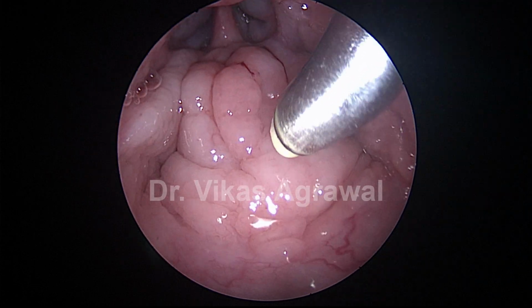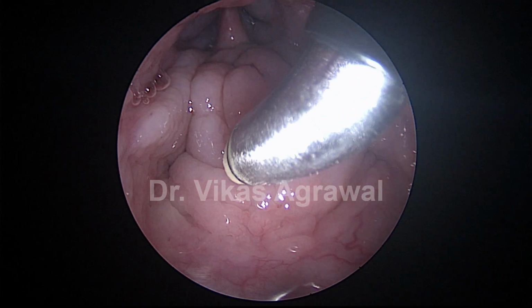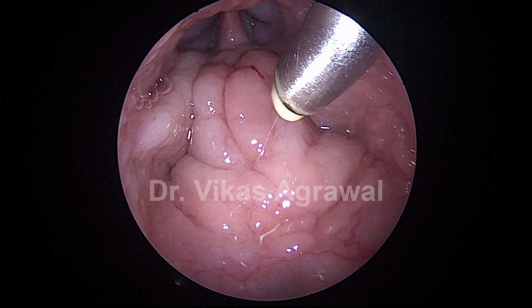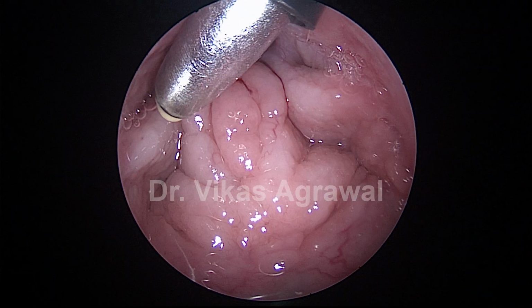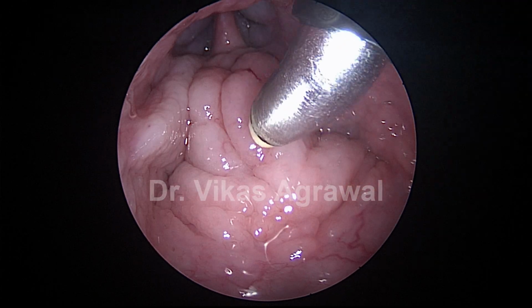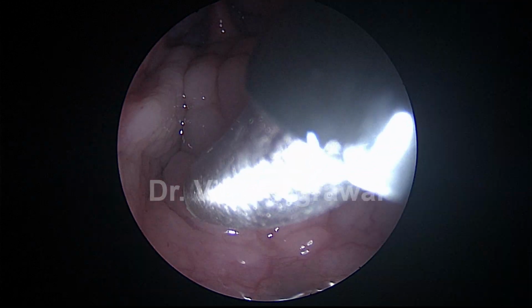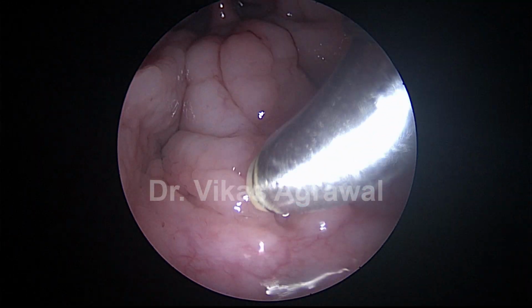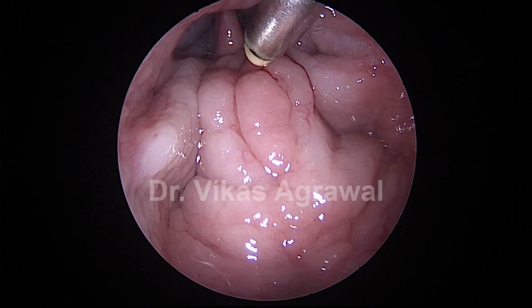So here you are watching adenoidectomy in a 2.5-year-old child, for which we have also performed intracapsular tonsillectomy. The child was having grade 4 adenoids. We had given betamethasone for 7 days prior to the surgery, and you see the adenoids have regressed a little. So this is the boundary. This is the Torus tubarius. This is the Passavant's ridge, and that's the choana.